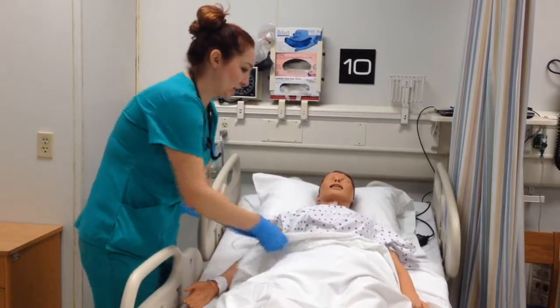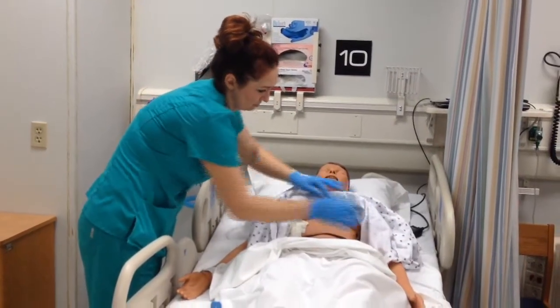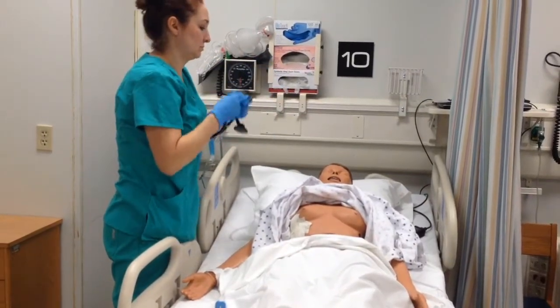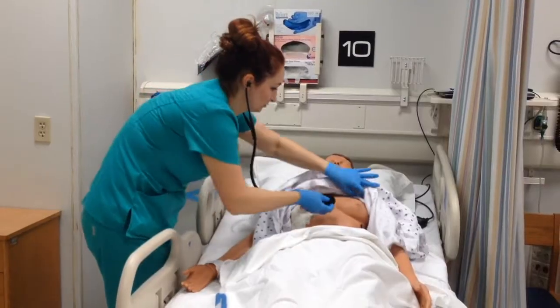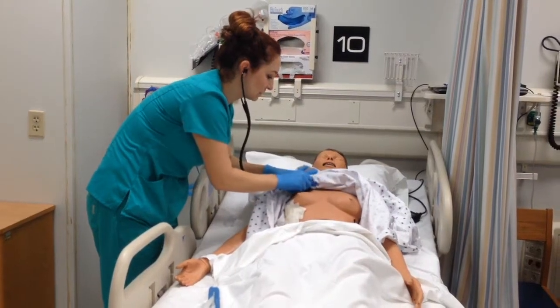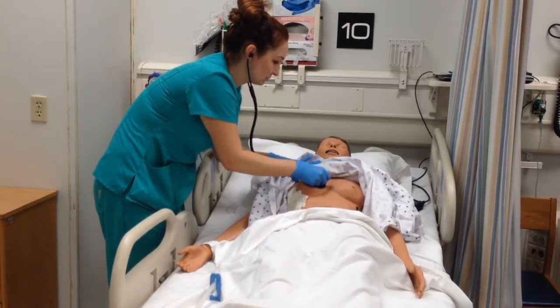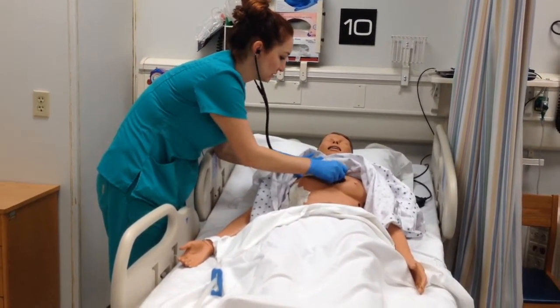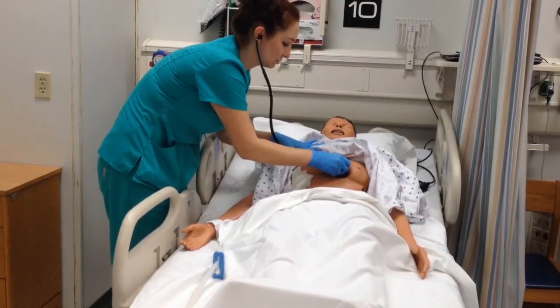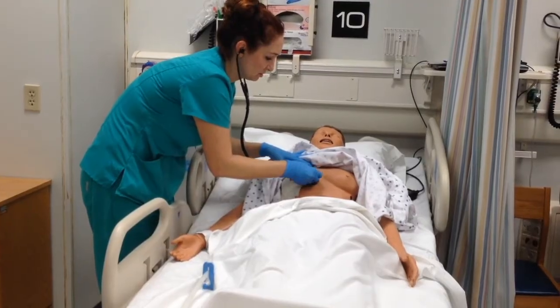I'm just going to pull your gown down a little bit so that I can get to your chest. I'll listen to your lung sounds. Take a deep breath in and out for me. Deep breath in and out. Again. Deep breath in and out.